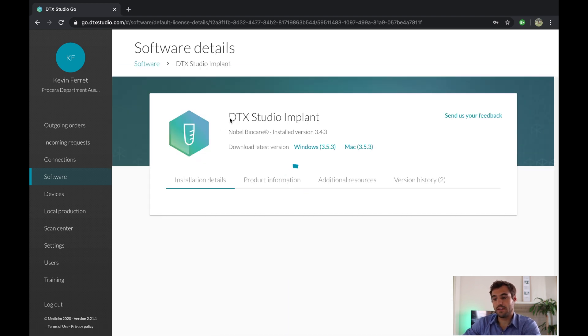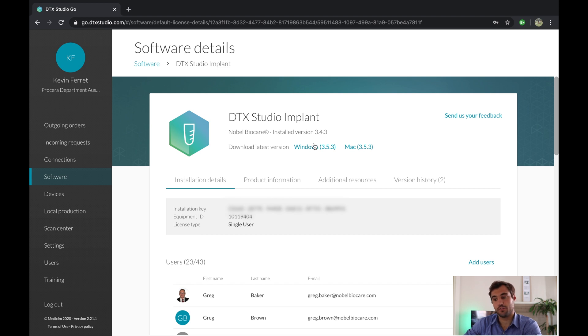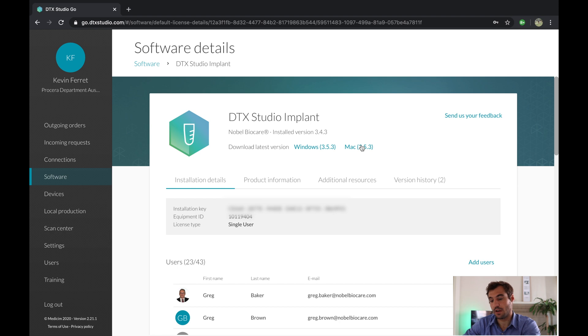Once there, you're going to see DTX Studio Implant Noble Biocare with the latest version, and you're going to have the option to download the Windows version or the Mac version. I'm currently working on a Mac, so I'm going to download the Mac version.